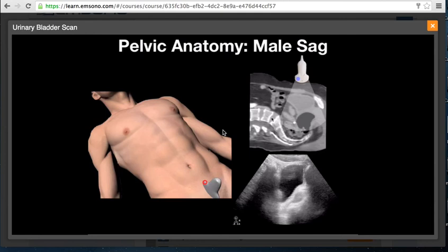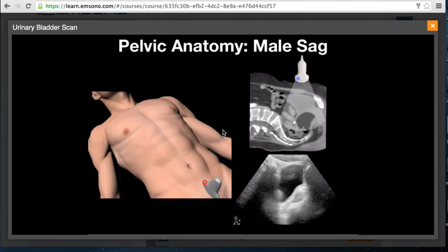A sagittal CT view helps explain this window. The urinary bladder is just cephalad to the pubic symphysis. Make sure to keep the transducer as close to the pubic symphysis as possible and avoid placing it up high near the umbilicus — unless the patient has over a liter in their bladder, you will not see it. Keeping the transducer low in the pelvis provides a view of the urinary bladder, prostate, seminal vesicles, and peritoneal cavity in the cephalad direction.